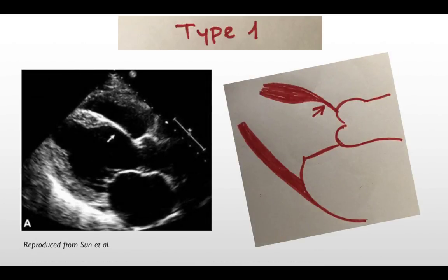In another view, in the left parasternal long axis view, you can see the same finding clearly as thinning of the basal part of the septum. And you can obviously see the difference between the base of the septum and the mid septum, how they look very different in thickness.